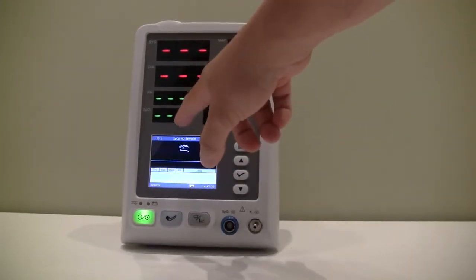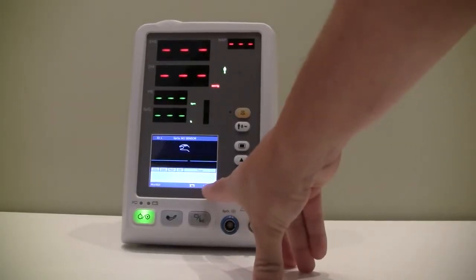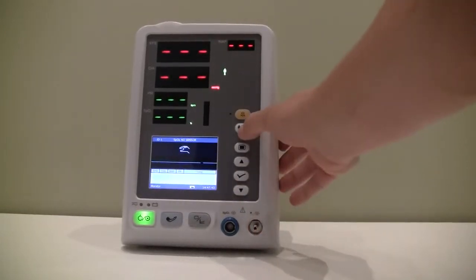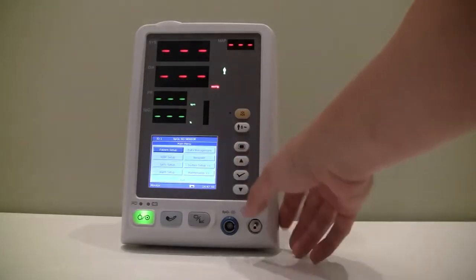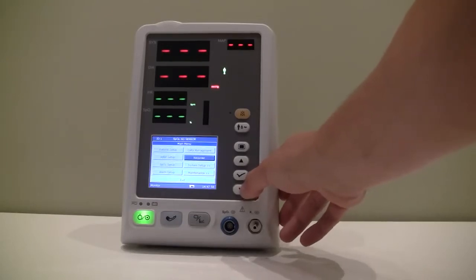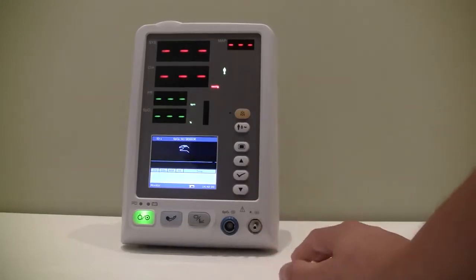Systolic, diastolic, pulse rate, SpO2, mean arterial pressure, and it has a 3.5-inch LCD display here at the bottom of the screen. Alarm key, you can switch your patient type here with this button. There's a shortcut button. This button here is for your main menu, and your up and down arrows, and your check button in the middle to select the appropriate option on the menu screen.